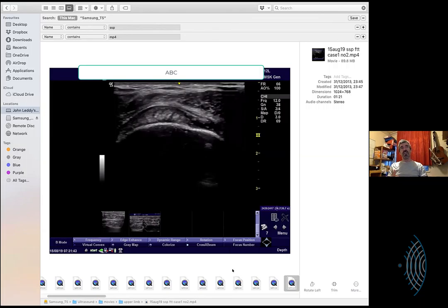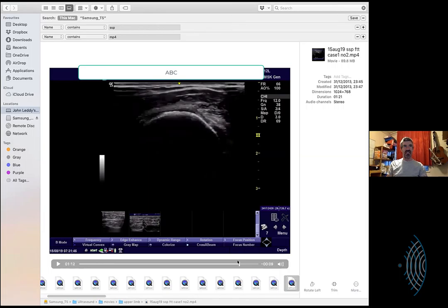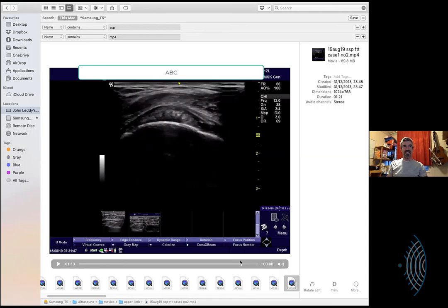There you go. There you see it. Wow. See the infraspinatus there? So infraspinatus is multipinnate? Yeah, yeah. Certainly, when you get a little bit of edema going on there, you can see it. But everything is multipinnate when you think about it. Yes, yes. Even a single pinnate has different fascial attachments. Yeah, but infraspinatus is very markedly like that and routinely like that.